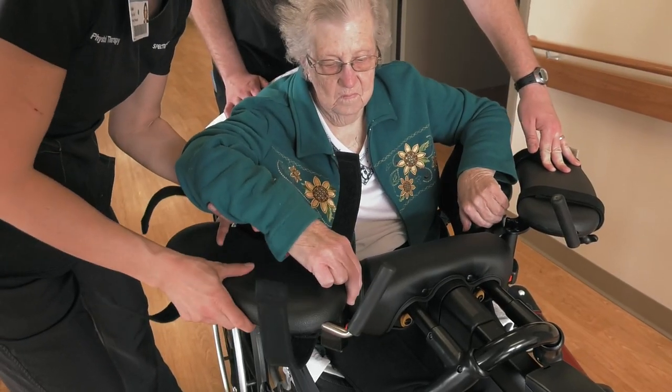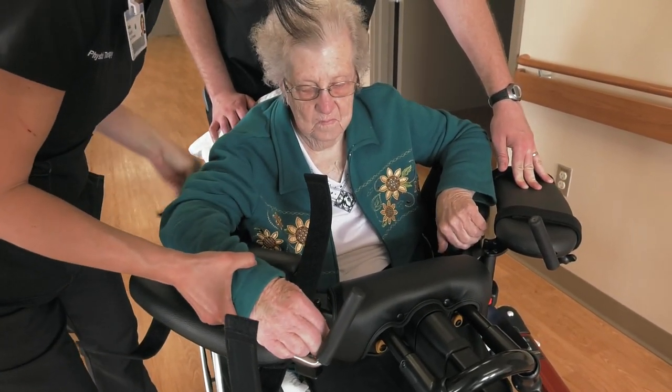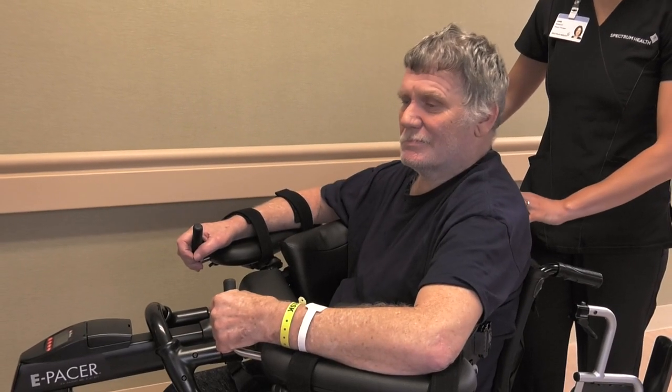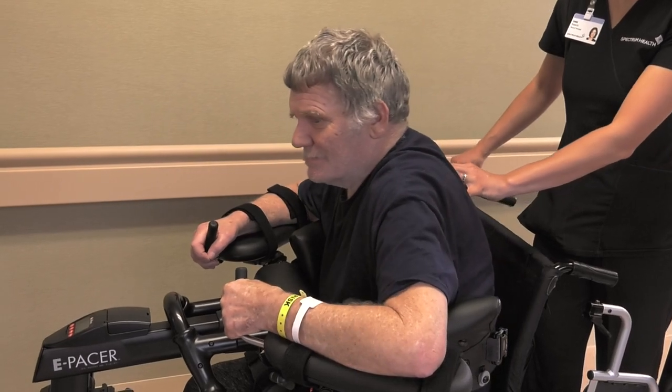Lift the patient's weak arm and then back the E-pacer up until the patient's chest is resting on the chest support. Support the patient's trunk as needed to facilitate an upright posture.